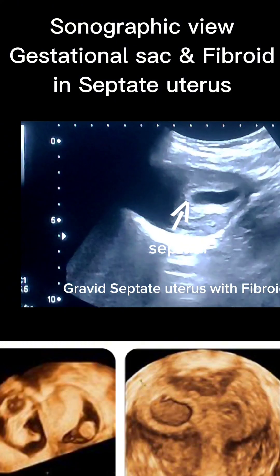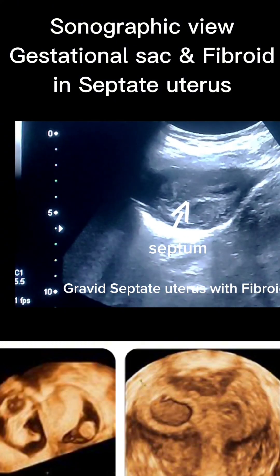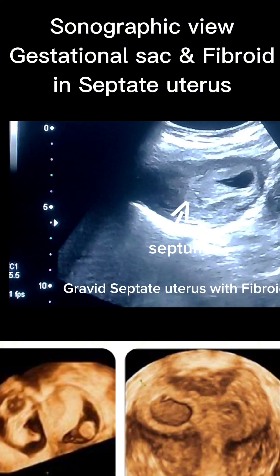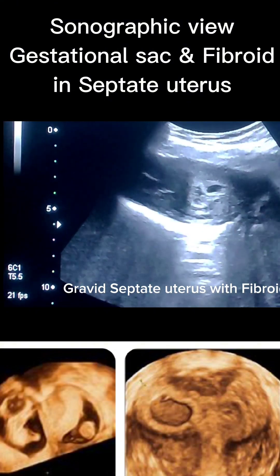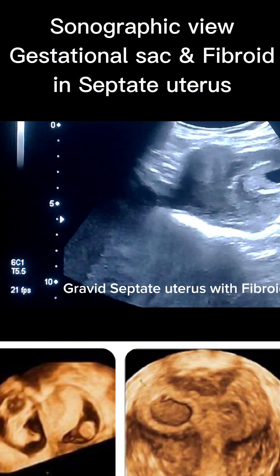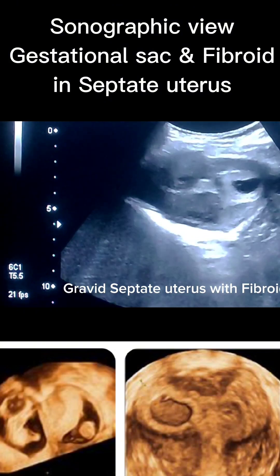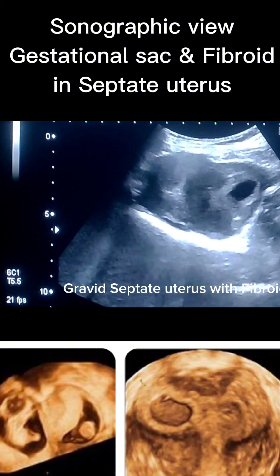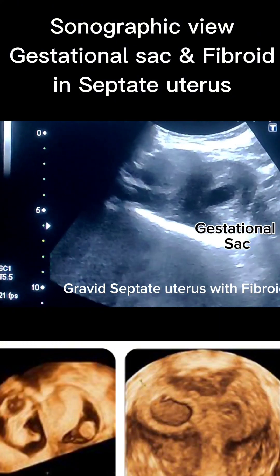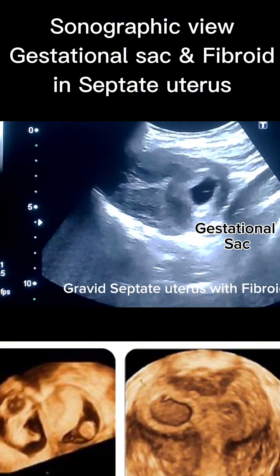The gestational sac was located in the left horn of the uterus, confirming that implantation occurred within the endometrial lining. The sac appeared regular and eccentrically placed within the horn, consistent with a normal implantation within a septate uterus.